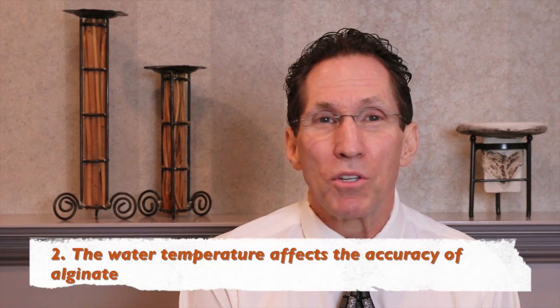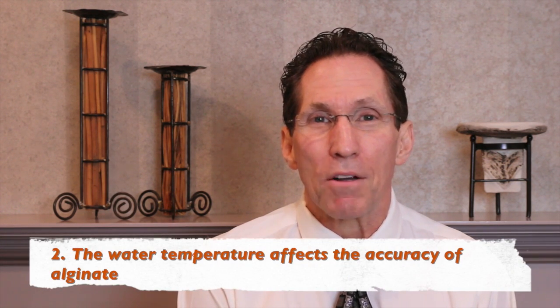The second misconception is that the water temperature affects the accuracy. Once again, this is a myth. The water temperature really only affects the setting time. And we're also going to use that to control our setting time.